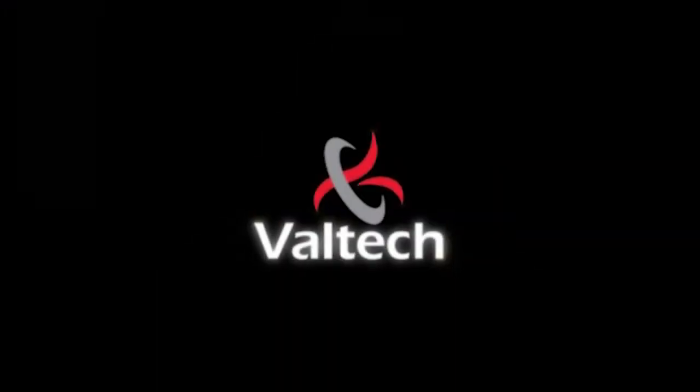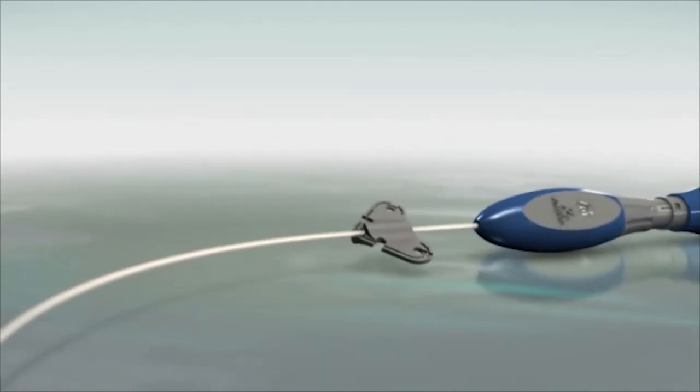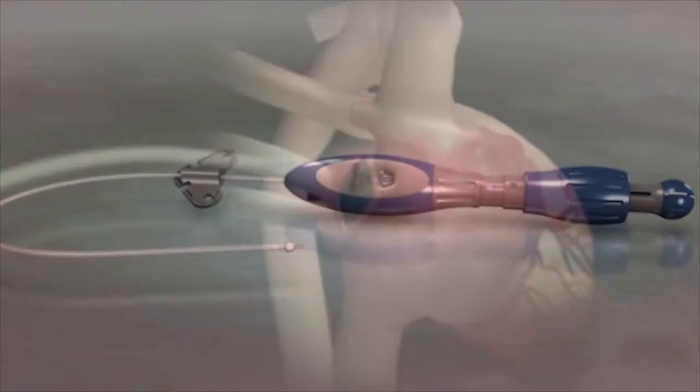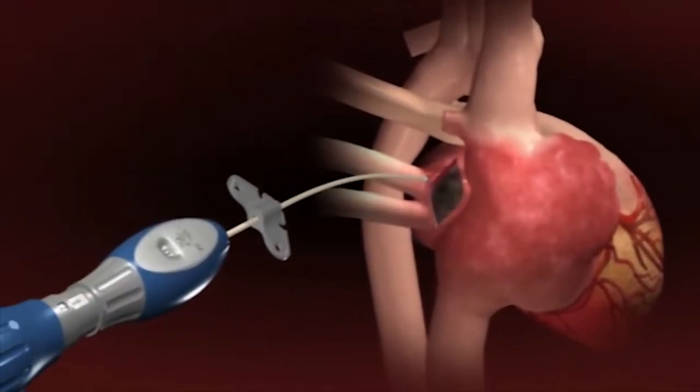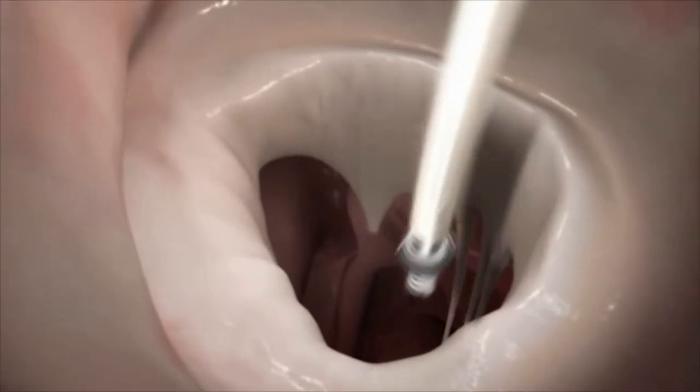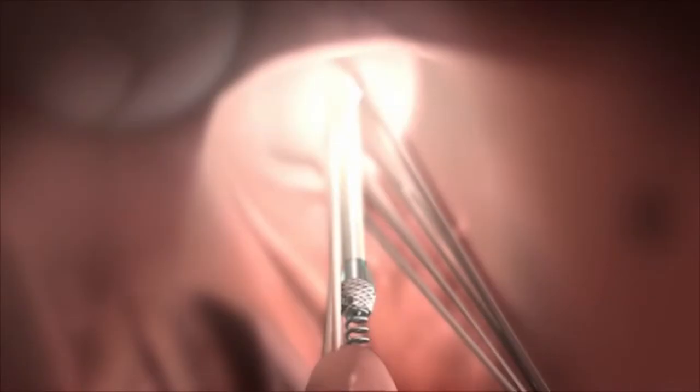Valtech introduces V-cortal, an off-pump adjustable artificial cord and implantation system. V-cortal is inserted into the left ventricle through the atrium, and its end is positioned on the tip of the papillary muscle.